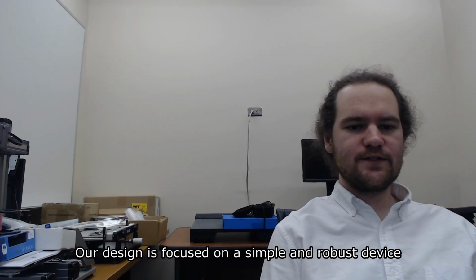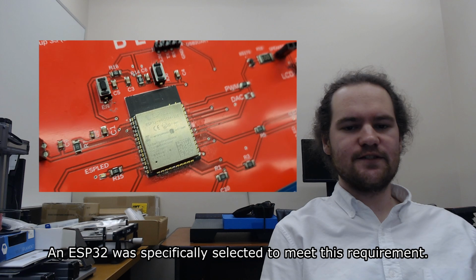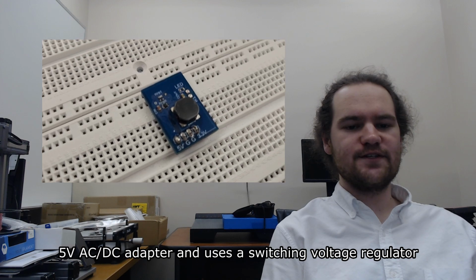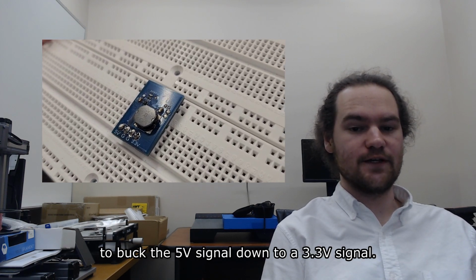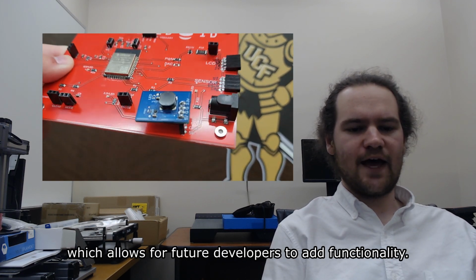Our design is focused on a simple and robust device that can be expanded upon as the demands increase, and ESP32 was specifically selected to meet this requirement. Our device receives power from a store-bought 5-volt AC to DC adapter and uses a switching voltage regulator to buck the 5-volt signal down to a 3.3-volt signal. This voltage regulator can output 2 amps without any thermal issues, which allows for future developers to add functionality.